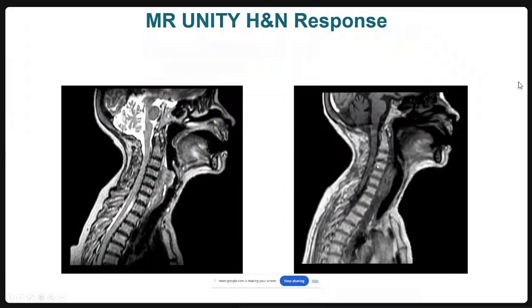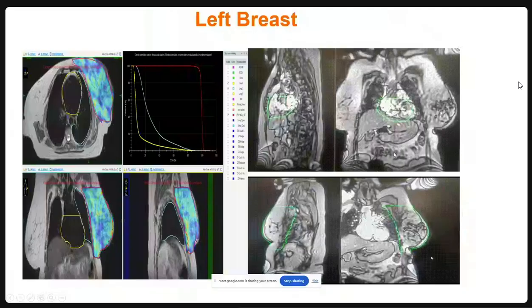This is again a typical patient treatment, the middle of the treatment, as you could see the beautiful response happening. So we can really reduce critical structures or target volumes, and then again save more of the critical structures, so we can avoid unnecessary toxicity to the patient.